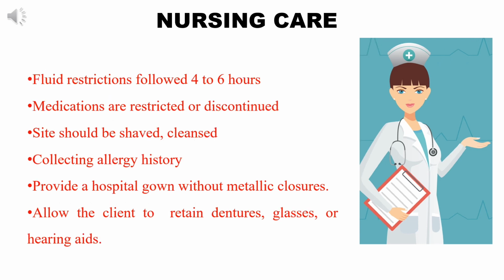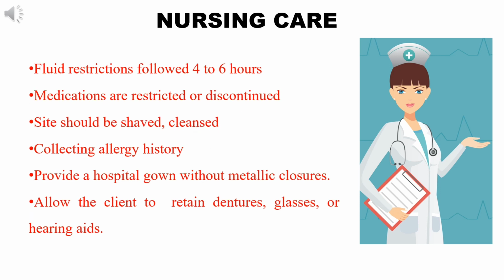Fluid restrictions are followed for 4 to 6 hours. Here, ensure that dietary and fluid restrictions have been followed at least 4 to 6 hours before the study. After that, medications are restricted or discontinued. Ensure that routine medications are restricted or allowed with permission from the physician, and that anticoagulant medications have been discontinued.